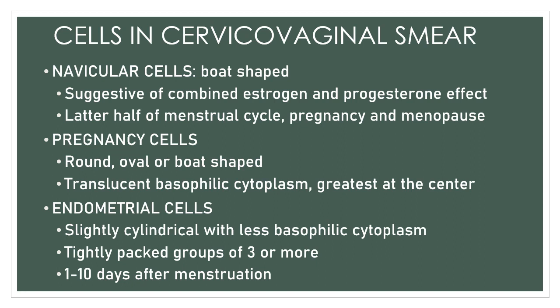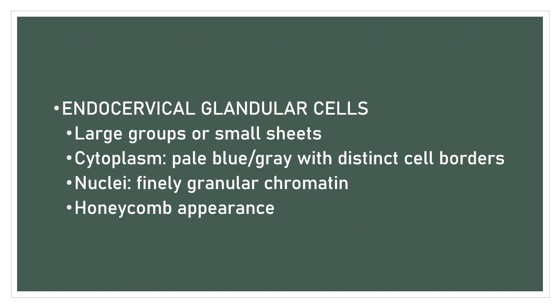Okay, and so you have your endocervical glandular cells. They occur in large groups or small sheets.